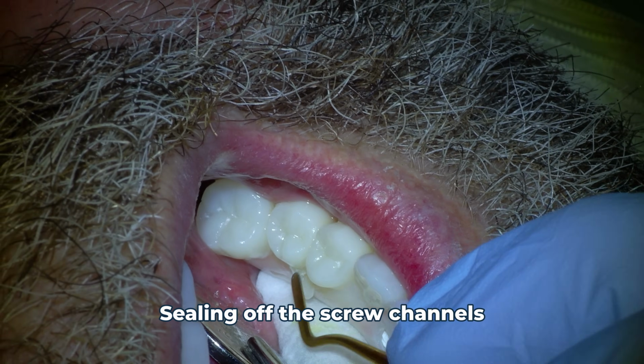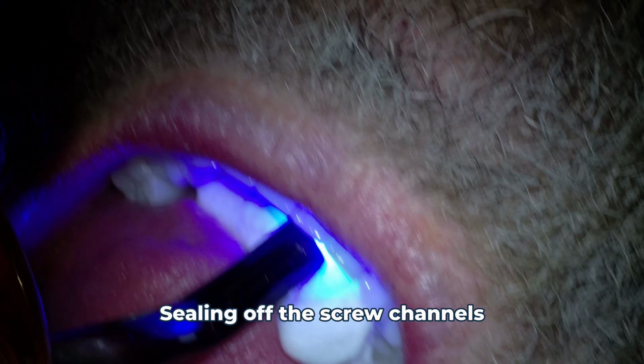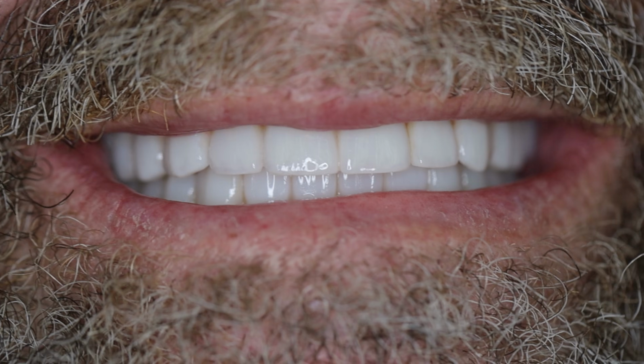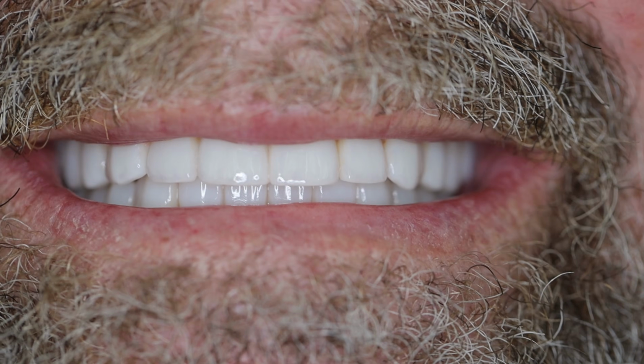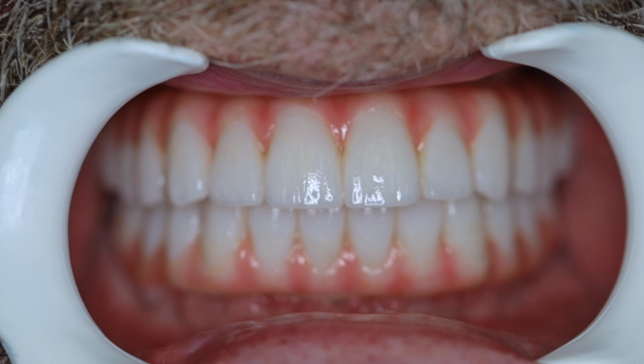And finally, we have arrived at the end. I love them, and so does the patient. It looks and feels as close to having your teeth back as you're going to get. And the patient is excited to eat all the food they loved once again. And this is the process of making permanent implant dentures.